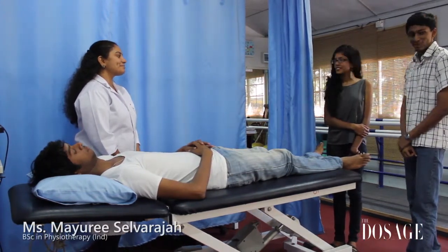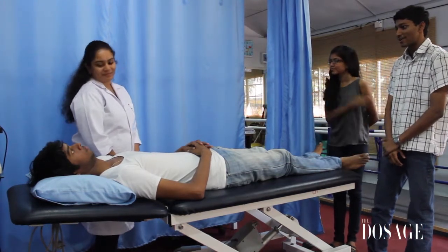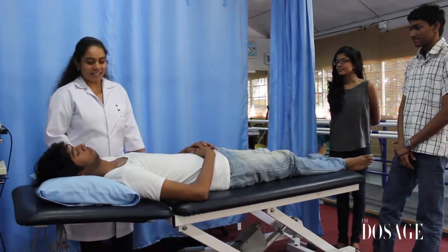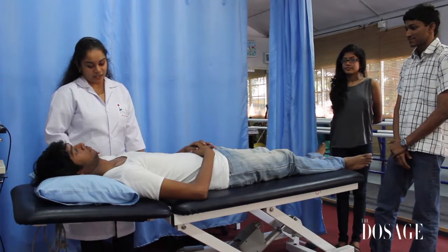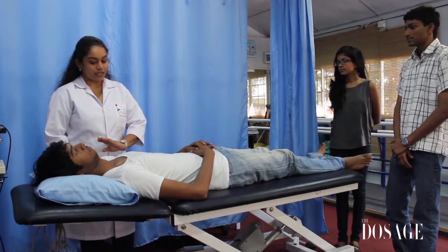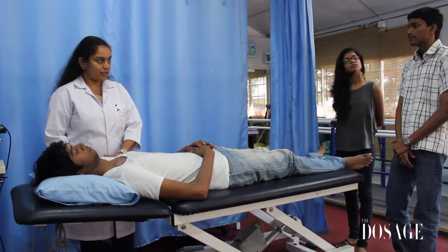So we're here today in this wonderful physiotherapy unit. I see you've got us a model lined up. What is his problem? First of all, welcome to our department. He's Mr. Pawan. He's a basketball player, and last week he got a direct injury in his shoulder, and I'm going to treat him with the ultrasound. Though it's an acute case, I'm going to treat him with the ultrasound for 6 minutes.